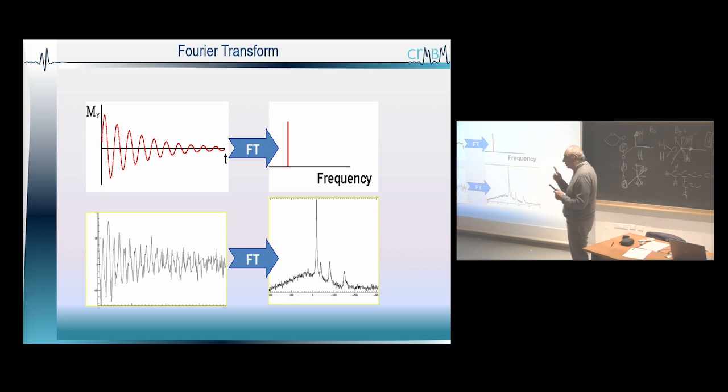But you're right, if you were able to get only one selective excitation, we'll touch only the proton from water or only the proton from fat, but not both of them. And the fact that we are using a pulse, we are exciting everything at the same time. But what is interesting is that when you remove this, the frequency is going to go back to each value, and we will be able to distinguish the frequency of water and the frequency of fat, or the frequency of different phosphorus, as you can see in here.